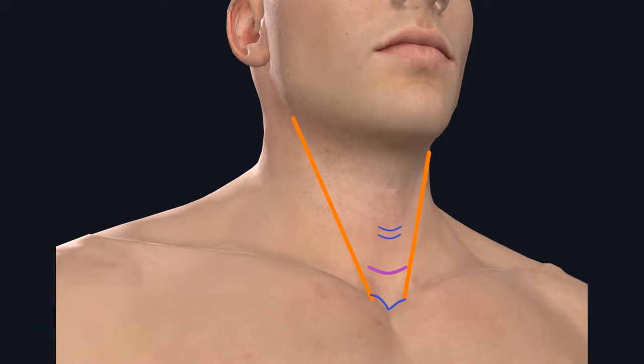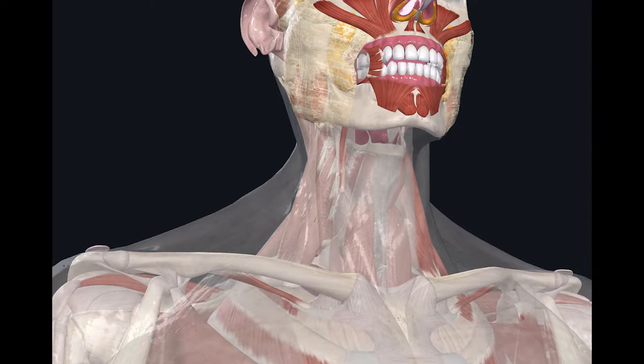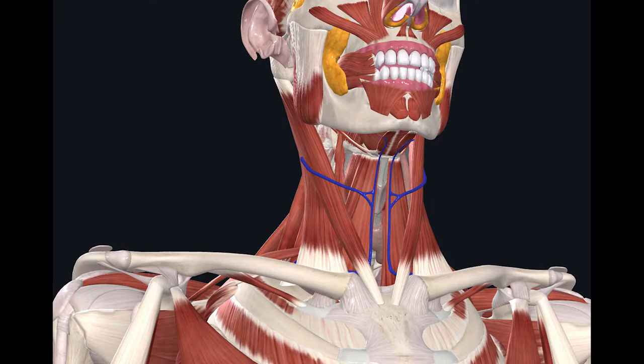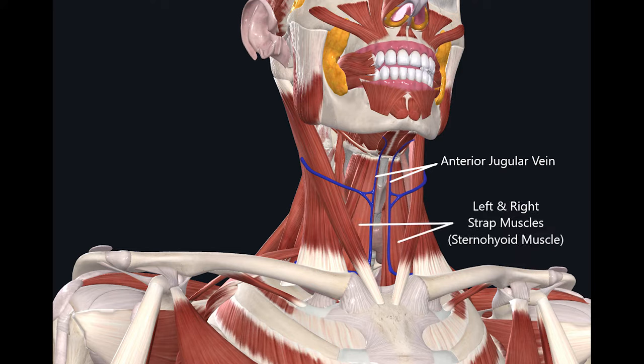Once you cut through the skin incision, the next layer down is the subcutaneous fat. As you go through the subcutaneous fat and before reaching the strap muscles, you may encounter a vertically oriented blood vessel. Most likely, this is going to be the ante-jugular vein, which is located superficial to the strap muscles. In some patients, the ante-jugular vein can be quite large, but it can be safely sacrificed without any complications.